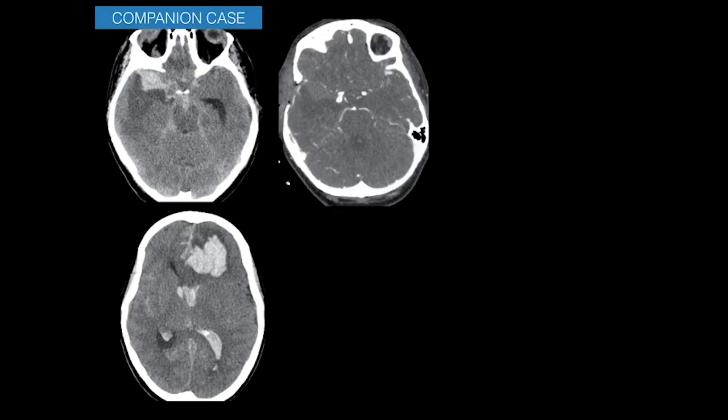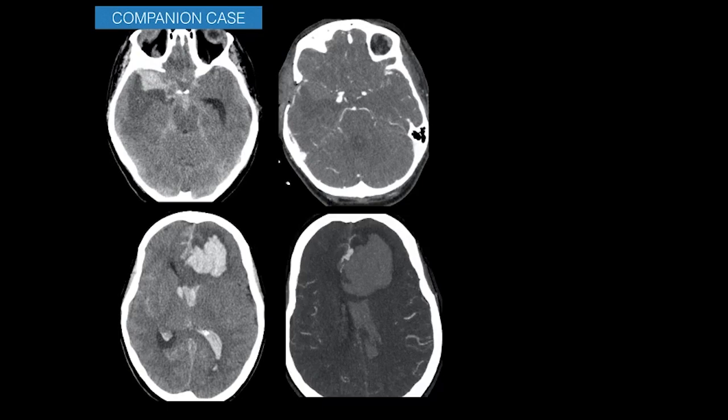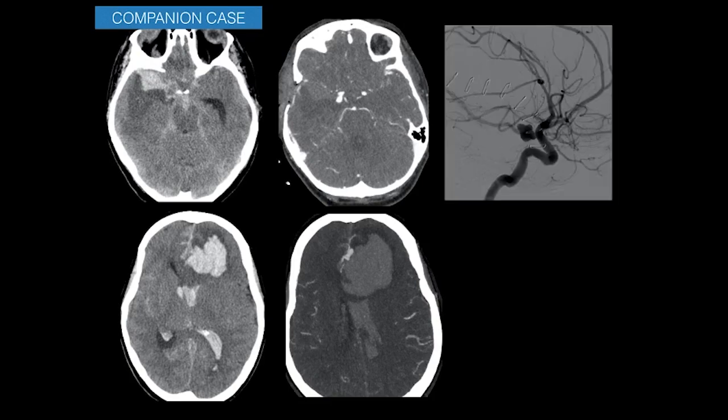Sometimes subarachnoid blood has associated extension into adjacent parenchyma. Two cases illustrate this: one with subarachnoid bleed and a parenchymal hematoma in the right temporal lobe, and another with predominantly parenchymal bleed in the left frontal lobe. CT angiogram showed a PCOM aneurysm causing subarachnoid and parenchymal hematoma in the first case, and a distal anterior cerebral artery aneurysm causing parenchymal hematoma with intraventricular extension and subarachnoid bleed in the second.